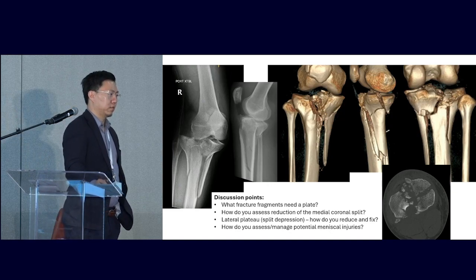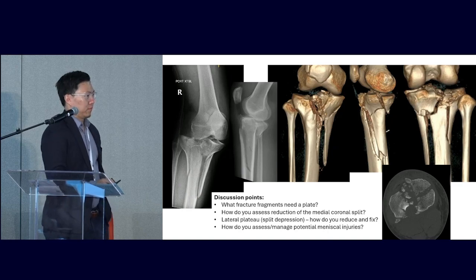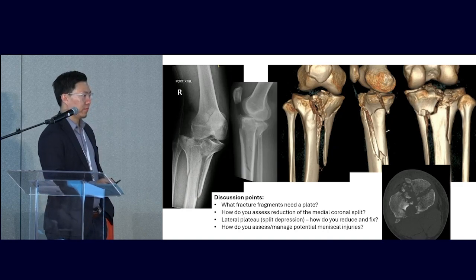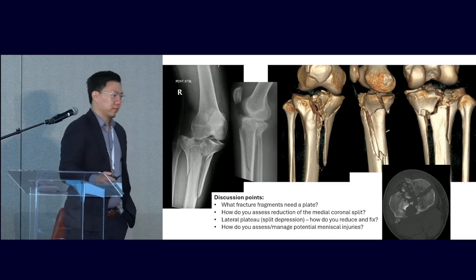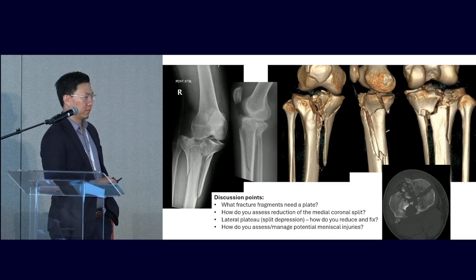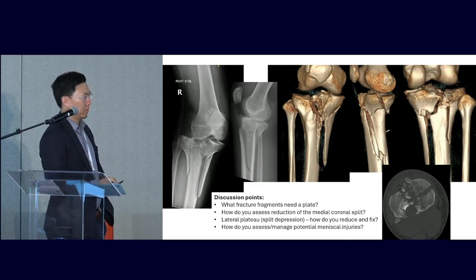So you've got to make sure that that's reduced. I'll go anterior, I'll try to flip it up and go through the fracture site. I'm not planning on doing a total knee, but I can get to both sides of the knee joint and lift up the articular surface. But it's that posterior medial piece that scares me. That has to be reduced and stabilized. So I might be doing a posterior approach, I guess. Okay, so you'd start anterior, work your way through, try to lift up that depressed segment and get as good a reduction. Right. And how are you going to get that posterior fragment pulled up into the construct?